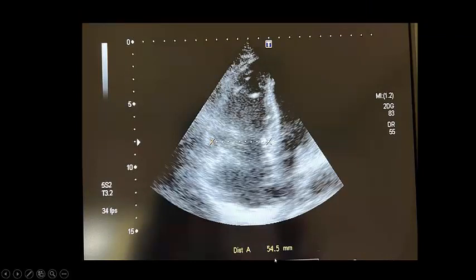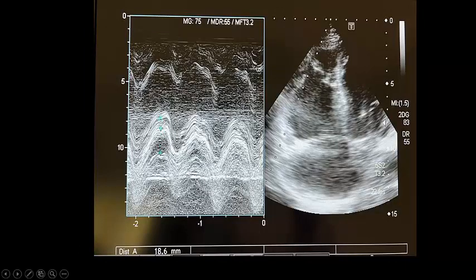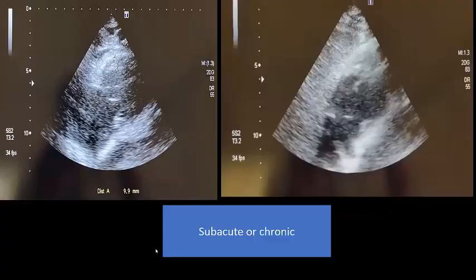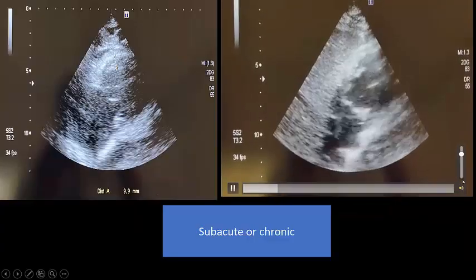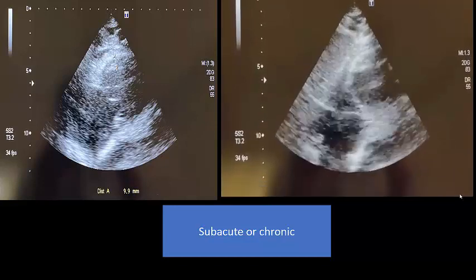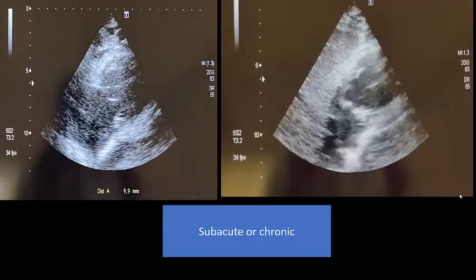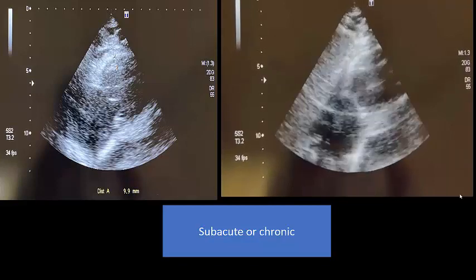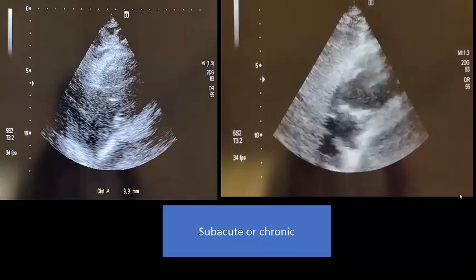The basal RV diameter is 5.4 cm — normally up to 4.1 cm in diastole. If you see the right ventricle larger than the left ventricle in diameter and size, it is markedly dilated. We measured TAPSE — the lateral tricuspid valve annulus movement — and it is more than 17 mm, or 1.7 cm, which means TAPSE is normal. If you see normal TAPSE with a dilated right ventricle, that means the right ventricle is compensated.